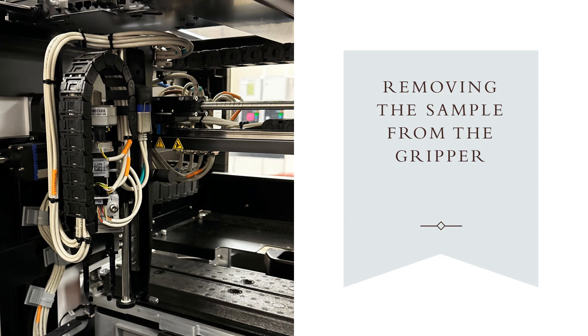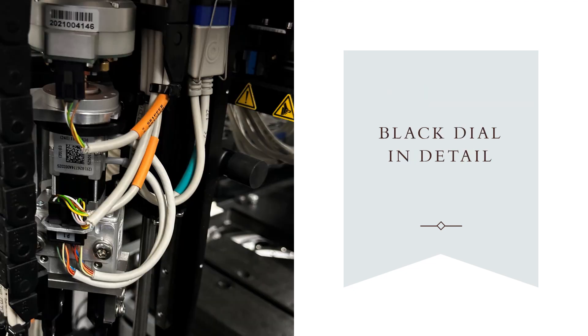This is the inside of the sample handler — a close-up of the robot arm. The red arrow indicates where the gripper will be holding the sample that's stuck, and the green arrow points to a black ribbed dial that is used to manually release the gripper from the tube. You can just turn the dial and it will release the gripper. Make sure you hold on to the sample while turning the black dial so that it does not fall into the analyzer. Here's a close-up of the dial to manually open it, included because it can be hard to see.